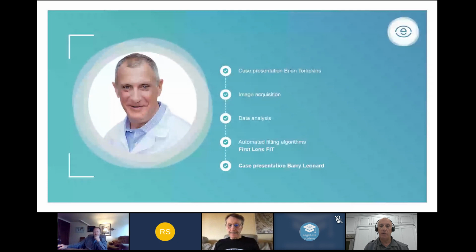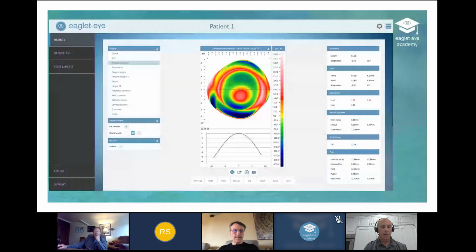So you can do that independent of the manufacturers, just in general. Art Wong is asking, is there a blog for ESP fitters to join? Tom answered it already. Okay, I think I have answered all the questions. So Barry, the stage is yours, your case, and I will go to the next slide.